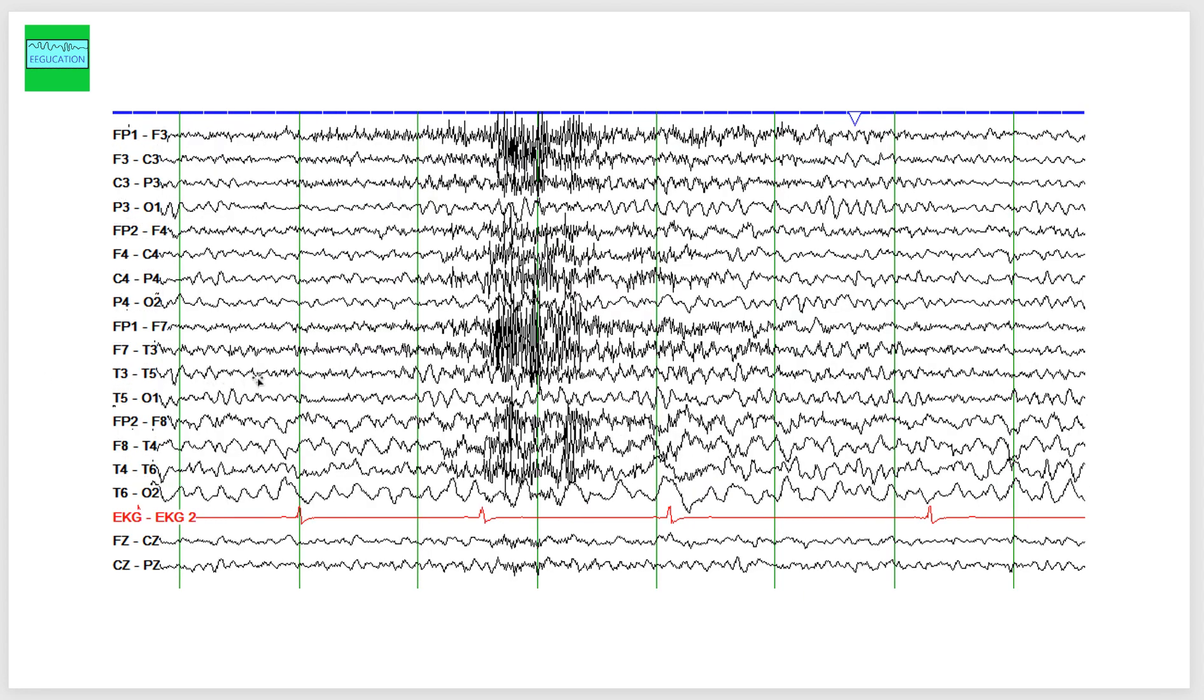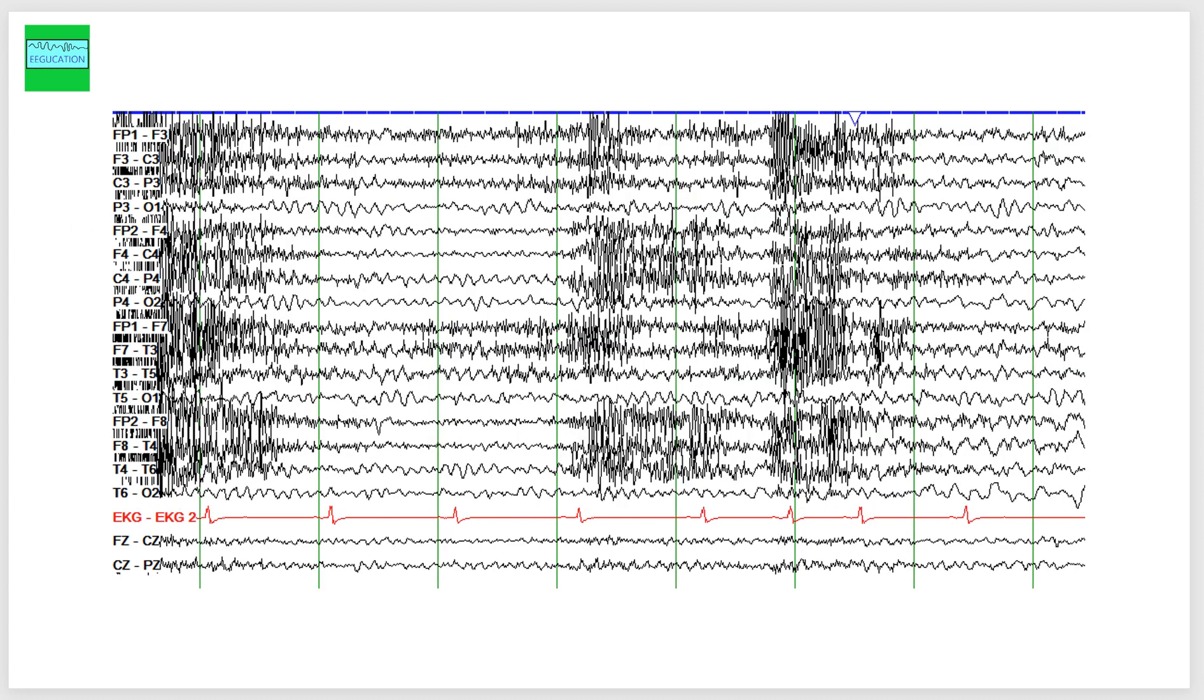So this is the next page here. You are able to see a posterior dominant alpha rhythm if you look carefully at P3O1. And if you look at P4O2, you do see some slowing there, but still there is some posterior dominant rhythm. If you go to the previous page, the posterior dominant rhythm is more clear. So this is the left side, this is the right side, and you are able to identify a posterior dominant rhythm of 8 to 9 hertz.